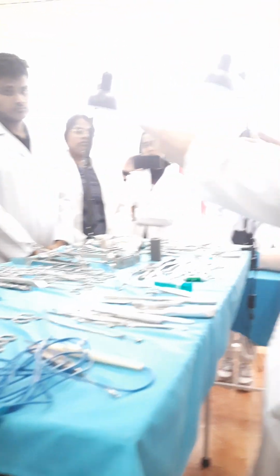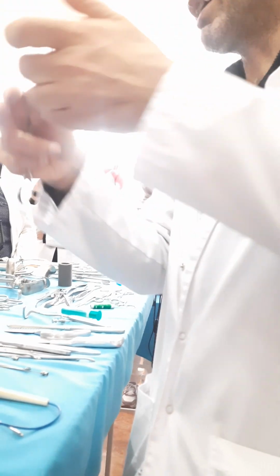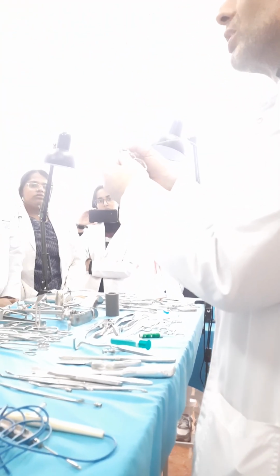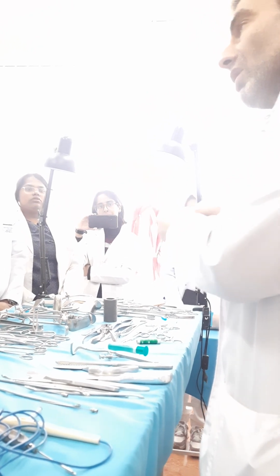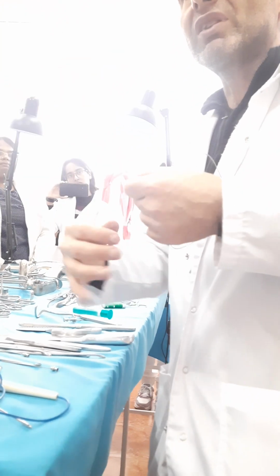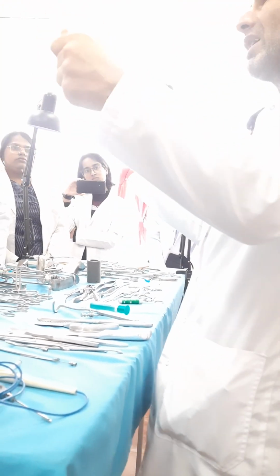Of course, you insert it from one aperture, you remove it from another aperture, and you connect it by the loop. The handles are removed, of course. Just like how you insert the thread into the eye of a needle, the same way you insert it into two apertures and start to make the incision.